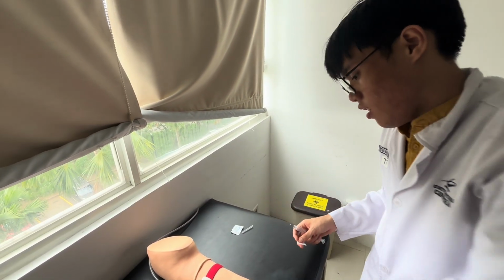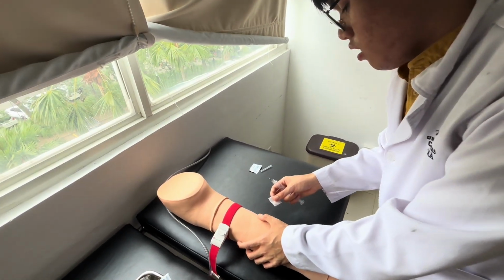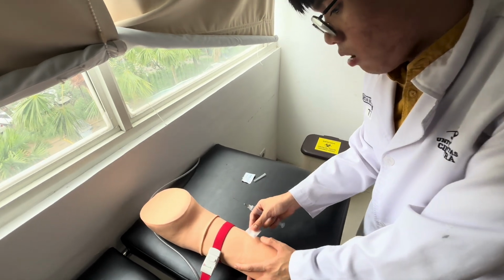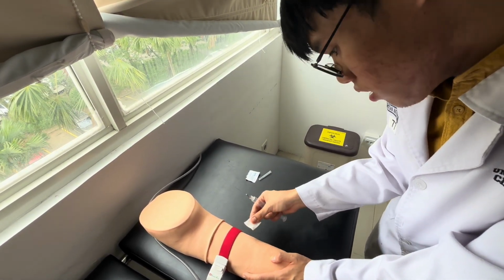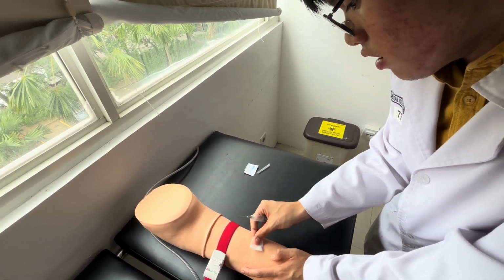an alcohol swab, and let's say I'm going for the vein right here. The median cubital vein would be the most commonly used and the easiest one. So just apply the alcohol swab. Make sure it's inside to outside.